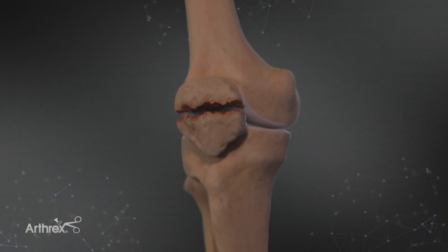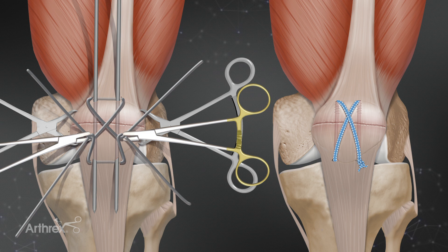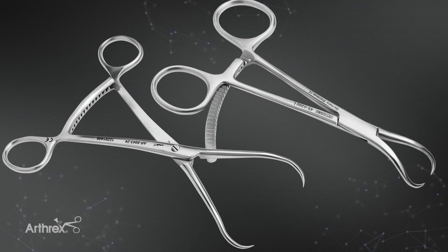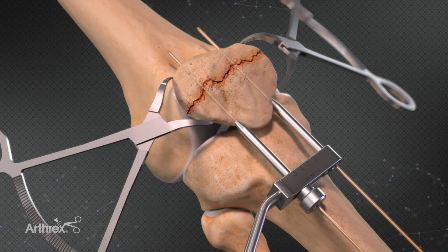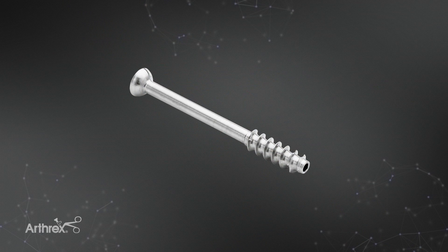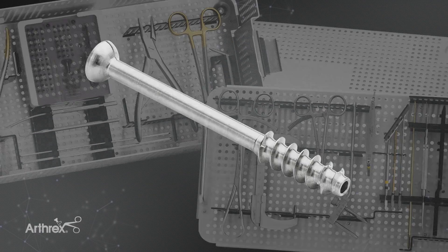Obviously the most common pattern is the transverse patella fracture. This system employs both surgical wires and fiber tape, which is shown to be even stronger for tension band fixation. The attachment of a needle to the fiber tape makes the process much smoother. We have a series of clamps specifically designed for patella fracture fixation to make placement of the guide wire simpler, more accurate, and easier to measure. We've also developed blunt tip screws that negate the possibility of cutting the fiber tape.